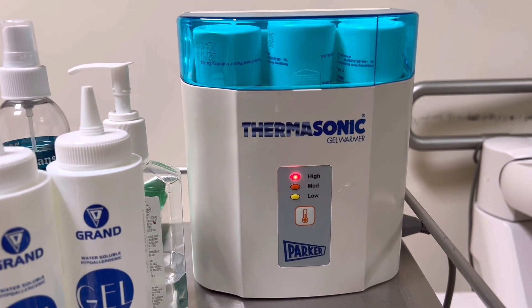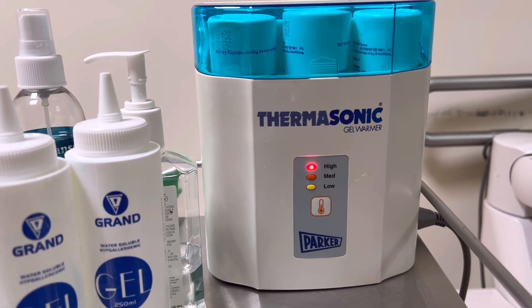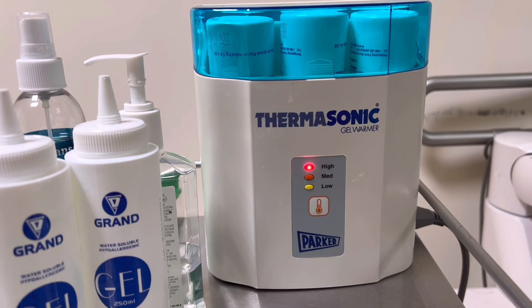Since patients may feel uncomfortable from the cold ultrasound gel, using this gel warmer will keep them at ease and comfortable during the procedure.